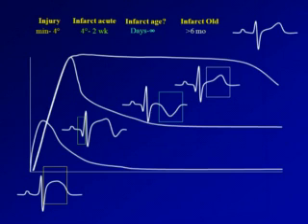And as the ST segment goes down, it pushes the T wave over and starts to push a Q wave down. So by about 4 hours, we start to see our Q wave, ST segments coming down, and our T waves flipping over. Now that appearance may go away within the next few minutes, particularly if you reperfuse the infarct, or it may last for up to 2 weeks in a normal evolution. So there, I've got a Q wave, so I know I've got a myocardial infarction, and I know it happened sometime in the last 2 weeks. So that's termed infarct acute.